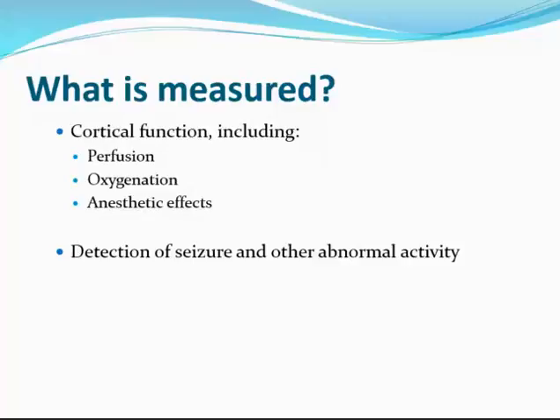Oxygenation, that's oxygen as a component of metabolic processes. And we also look at anesthetic effects. Drugs, of course, are inhibiting on the cortex, so they are also going to affect the way the EEG appears. We also use EEG for the detection of seizures and other abnormal activity.